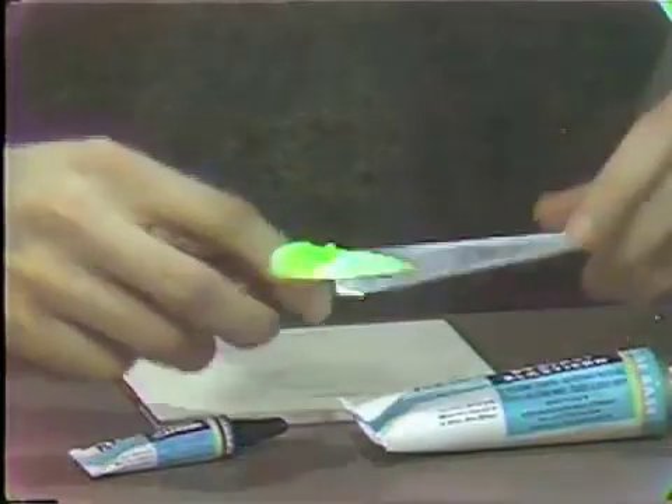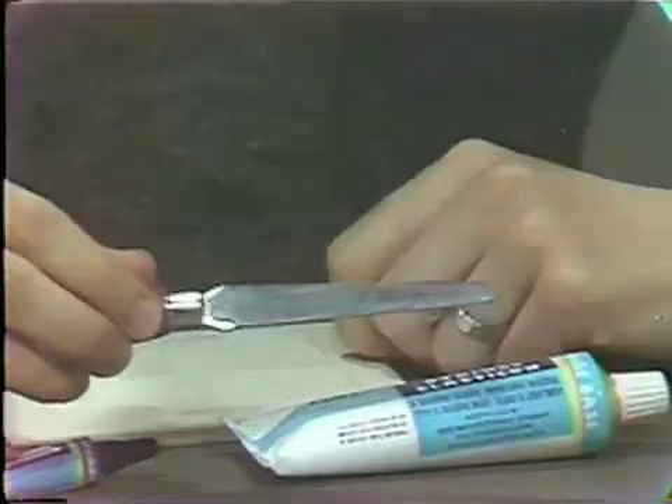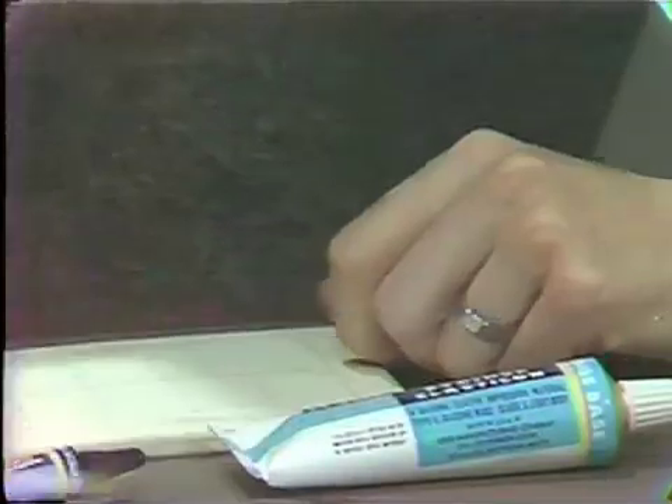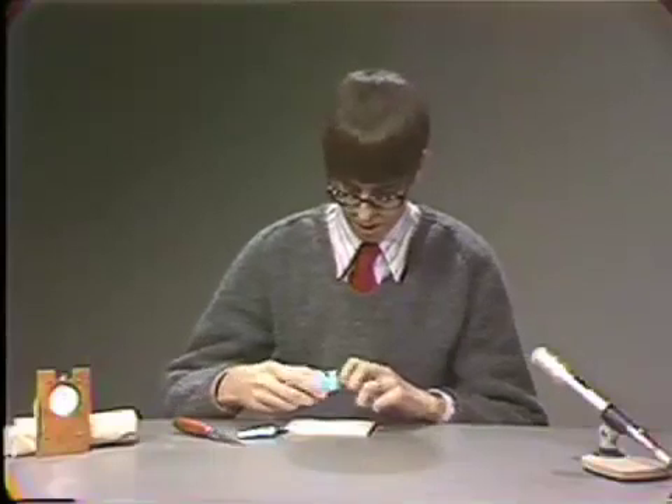A stiff spatula is necessary to mix the silicone impression materials. I will now demonstrate the mixing of Syringe Elasticon.